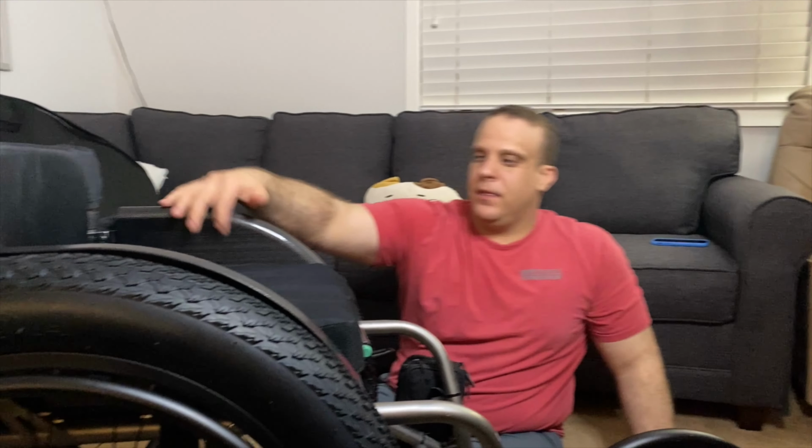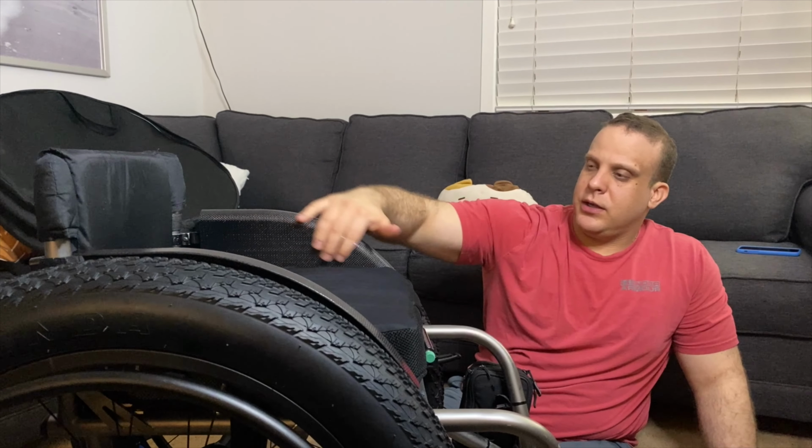And if I put my cushion back on, we still have plenty of coverage here for my hips and stuff, so I'm not throwing sand into my cushion if we need to. And at the end of the day, if we have to pull them off, we pull them off, and we wash the chair when we're done.